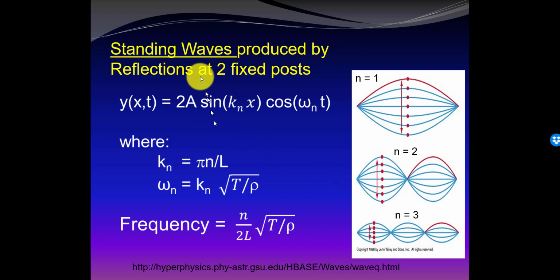They are fine, but in fact on the guitar we have standing waves or stationary waves instead, and they are produced because the waves reflect at two fixed points. That is what we talked about before, the bridge and the nut of the strings. A solution to standing waves looks a little bit more complicated than the previous one, and it shows a combination of sinusoidal patterns.